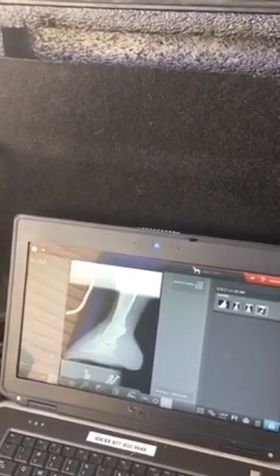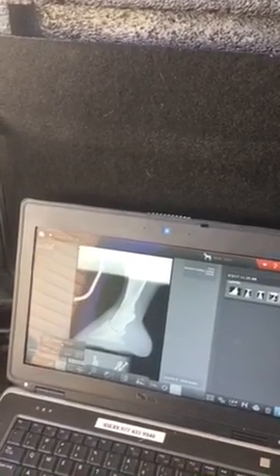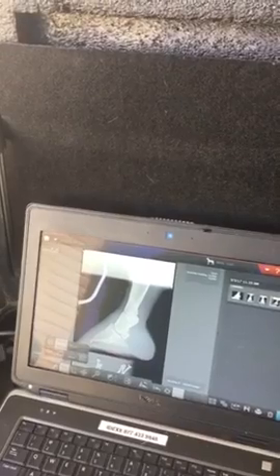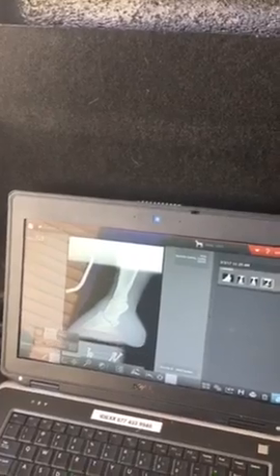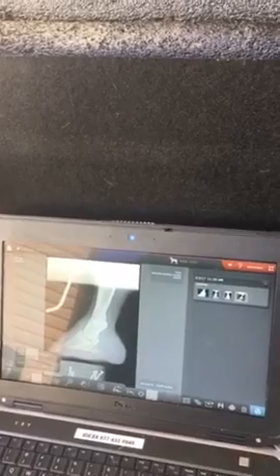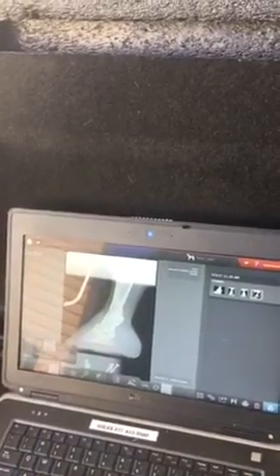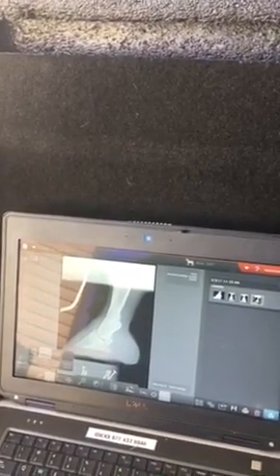But you can tell with the orientation of the ground, she's got a negative angle of her P3. So it's negative 1.32 degrees. What that means is she's putting more pressure on her deep digital flexor tendon and her navicular apparatus back here compared to if she had a positive angle. The other thing is she's putting more pressure there because this bony column should be straight.